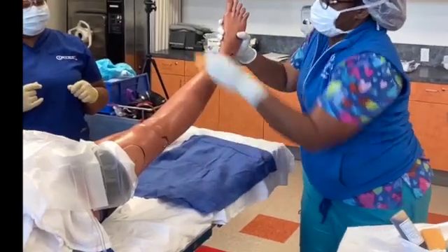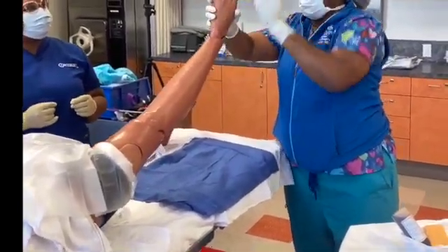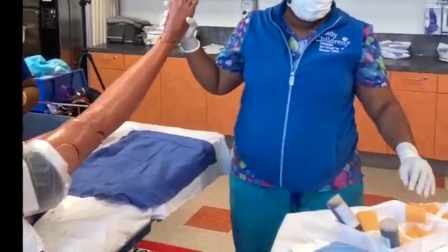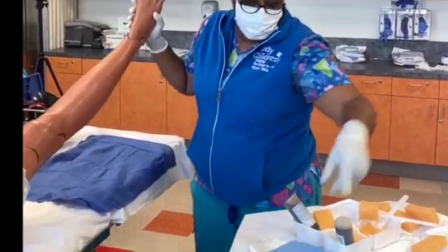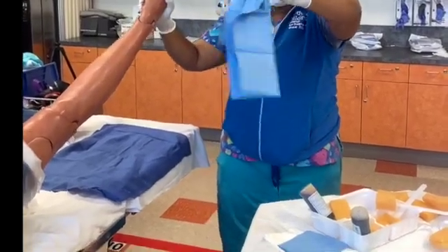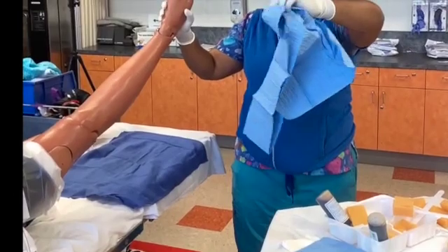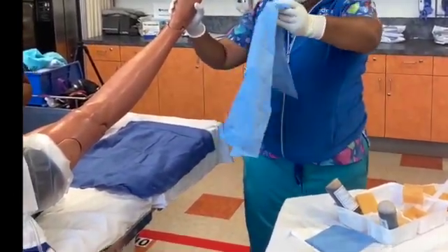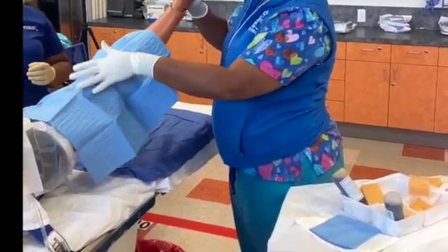Well, thank you. Remember what I told you in ortho, if it's not sloppy wet, they're going to think you did not do anything. Now this is where it gets kind of fun. If she's still in sterile gloves, she can help me drape or dry off the patient. But let's just say I'm one of those techs that don't really trust humans. You got to get used to being able to do things with one hand. And drape. And dry. Not contaminate. So you guys saw how I did that? One.